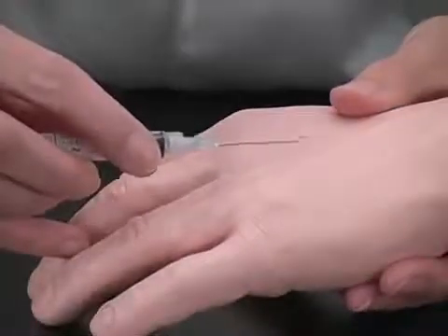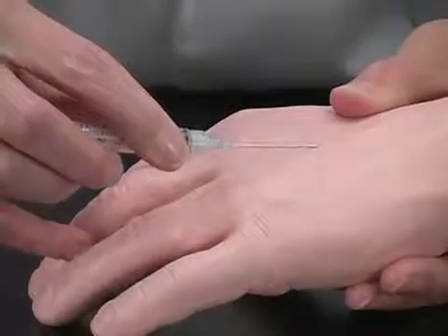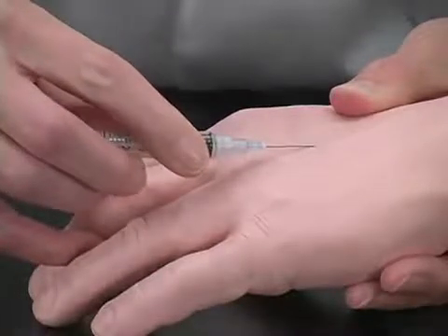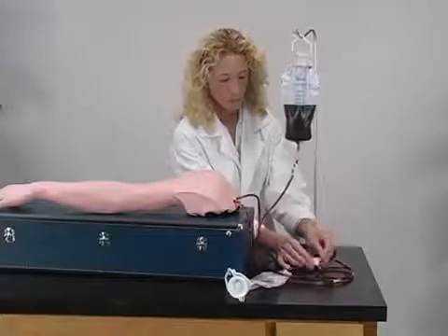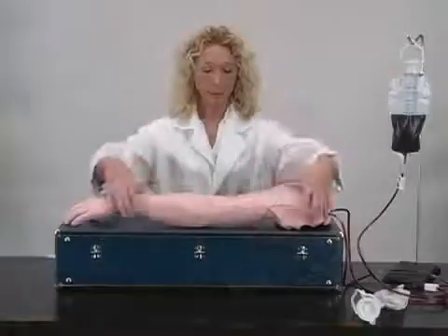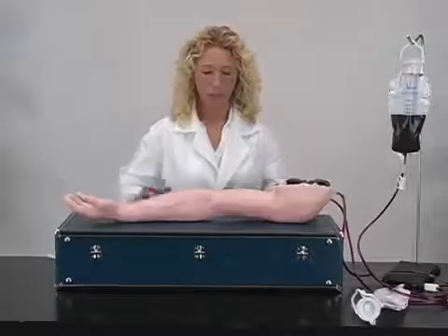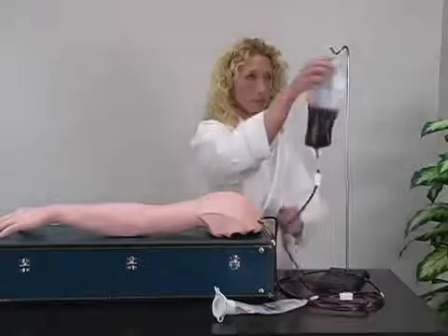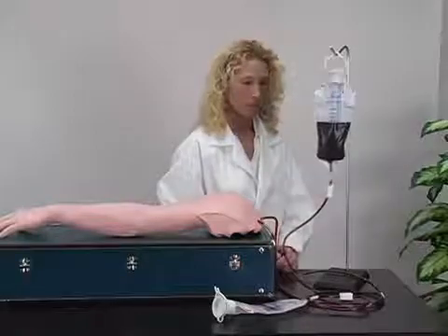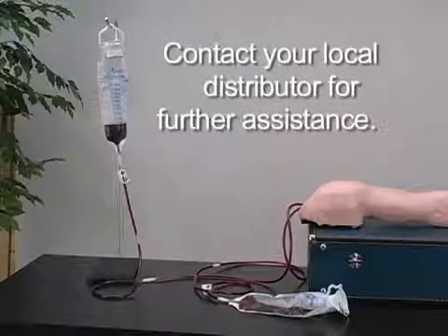If there is no blood withdrawal or flashback upon needle insertion, first verify that the needle is properly inside the vein. Next, check to make sure the arm is properly connected and pressurized. There may also be air trapped inside the veins — in this case, roll the arm over and watch for air bubbles to be released. Lastly, ensure that the IV bag is hung sufficiently above the IV arm. If these troubleshooting tips do not help, contact your local NASCO distributor for assistance.